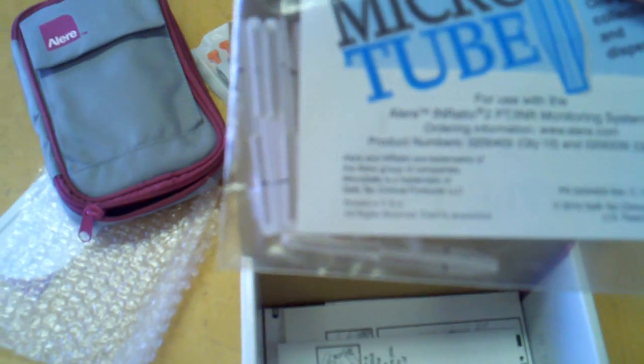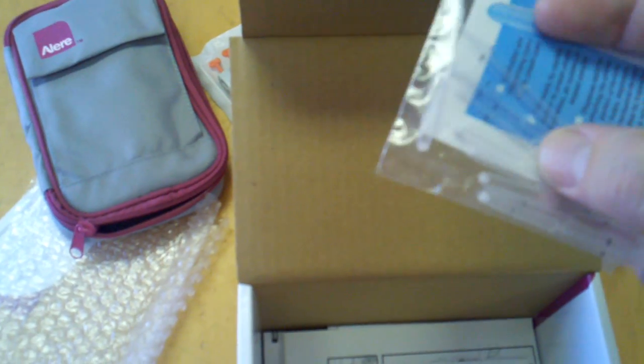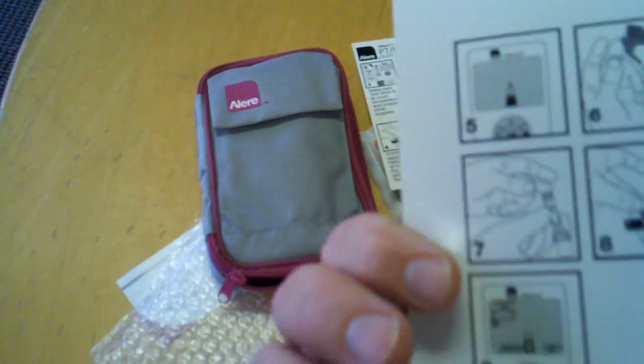You also get a couple of these microtubes, which are for use as a one-piece collection and dispensing system. You can see what they look like — that comes with it. It also comes with the quick reference guide, and there's another one here which shows you how to do it.